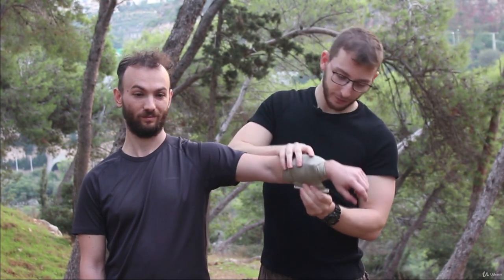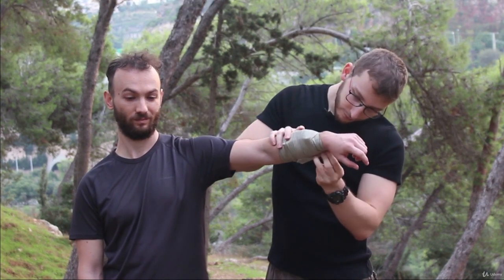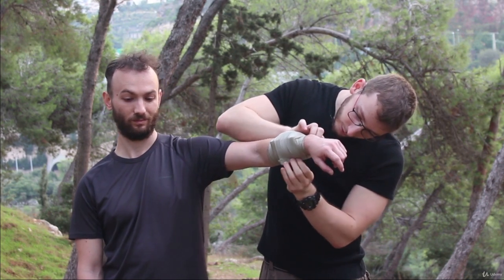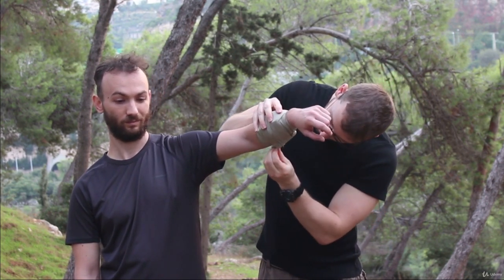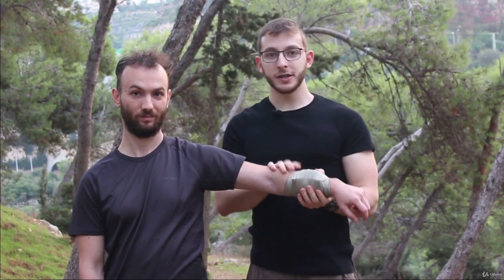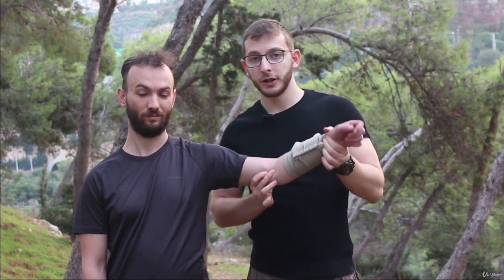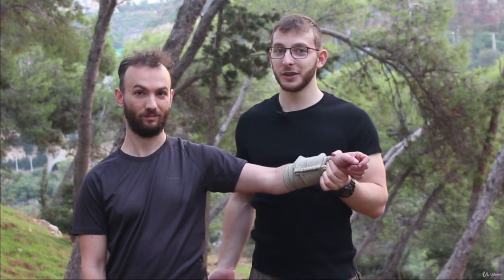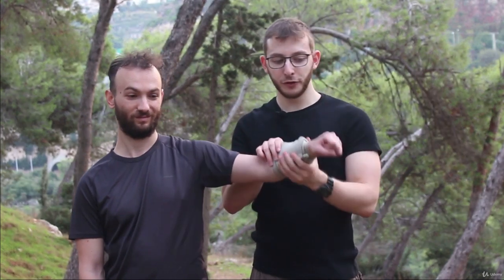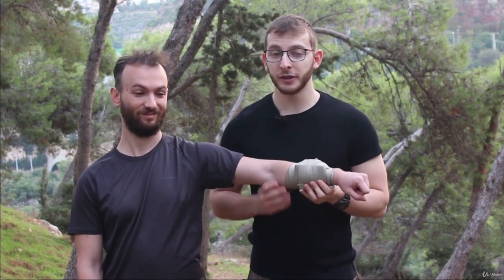So here I go. And now I just wanna clip it. Perfect. And as you can see, this is firmly in place. This cannot move. You do need to check his pulse to make sure that he has a pulse and we didn't put it way too strongly. Yeah, I can feel that he has a pulse and he can move his fingers, right? Mm-hmm. Perfect. So as you can see, this is how you place the Israeli bandage.